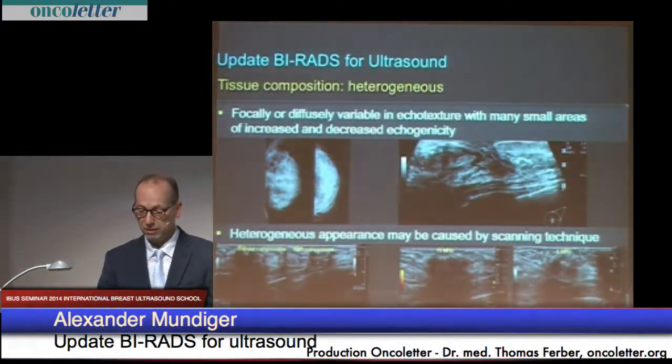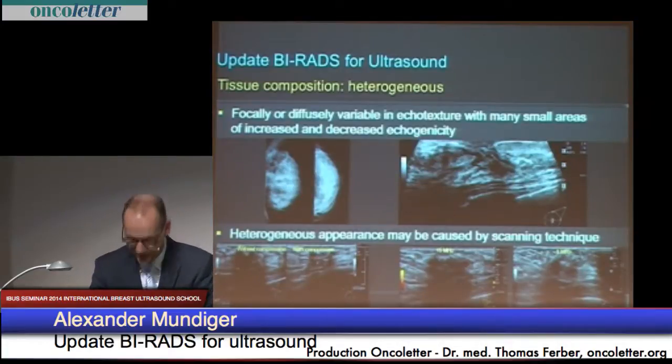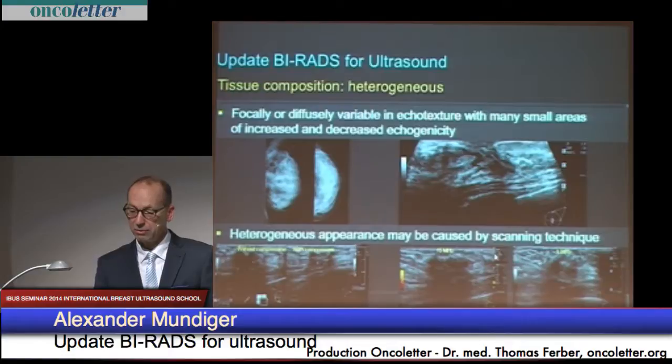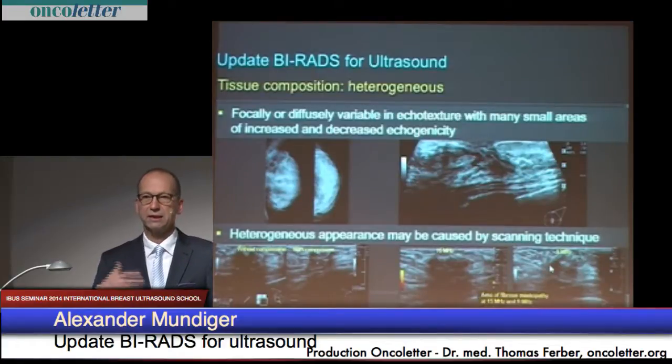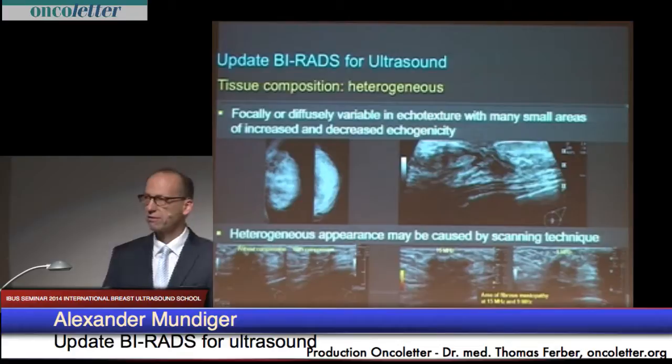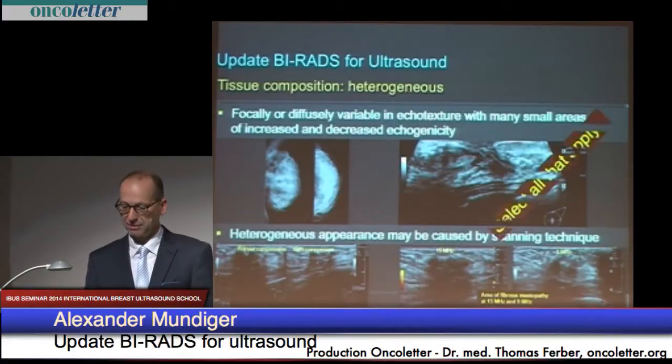And what I want to show you now is that with and without compression, and again, with reducing the frequency from high frequency to lower frequency, you will have a completely different appearance. So again, the idea is to use your methods flexibly.